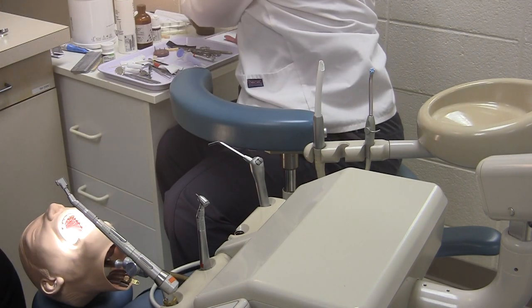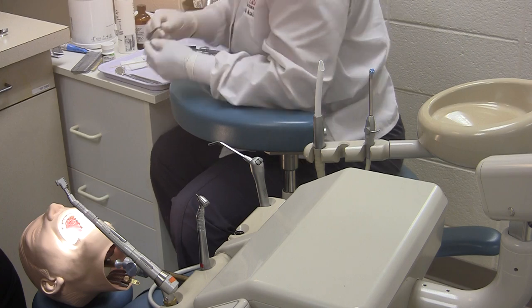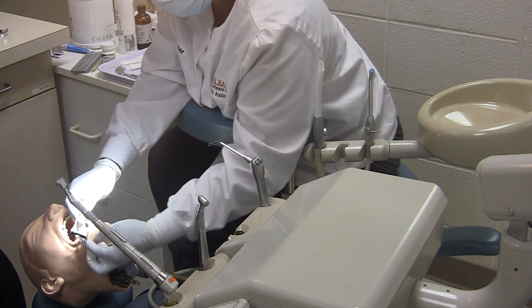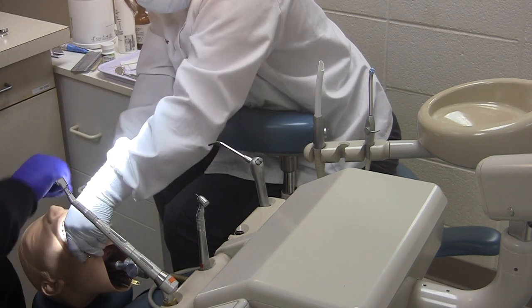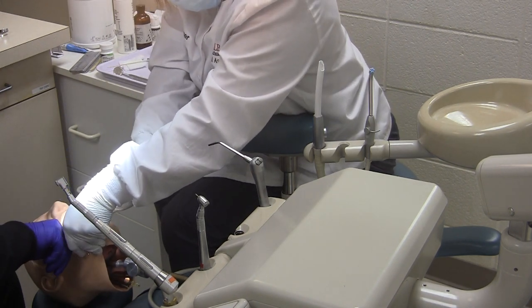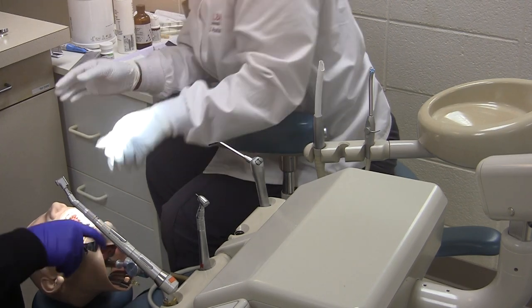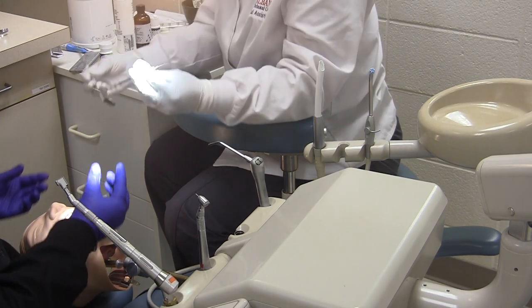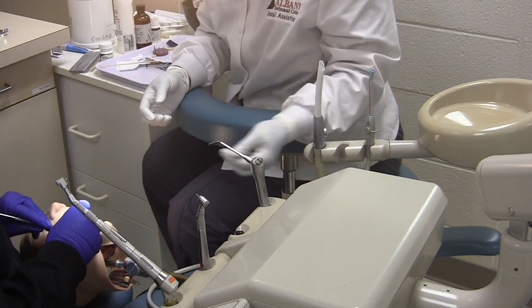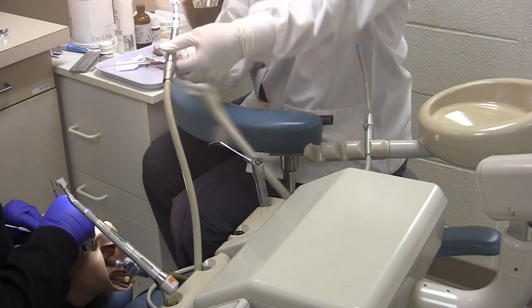After those are complete, the dentist will come back in and the assistant will place isolation. Pass the mirror and explorer. The dentist will then check to see if the anesthetic has taken full effect.